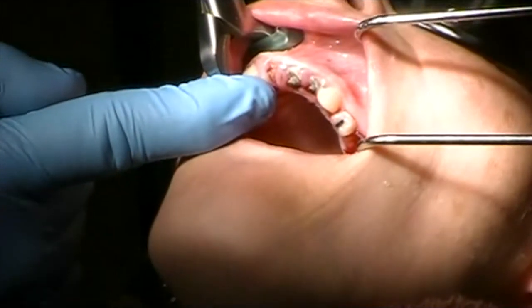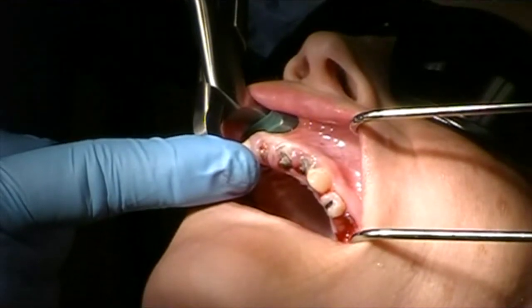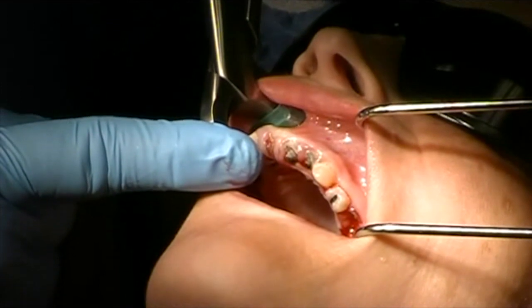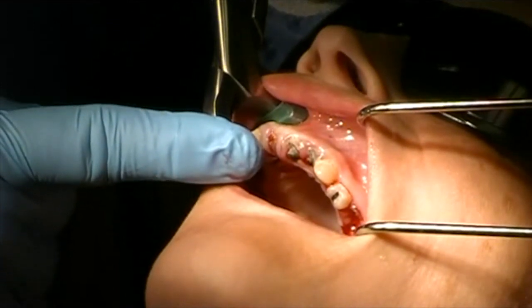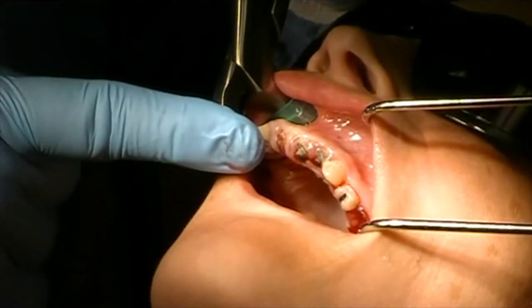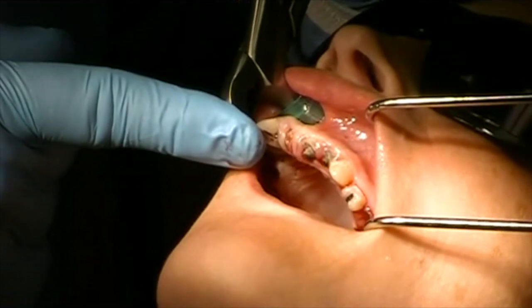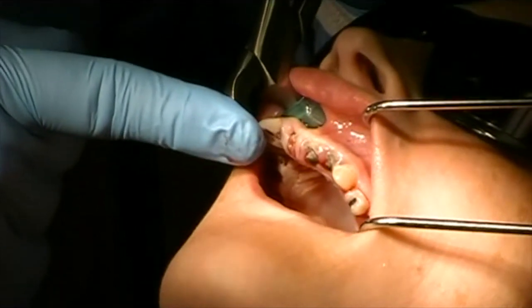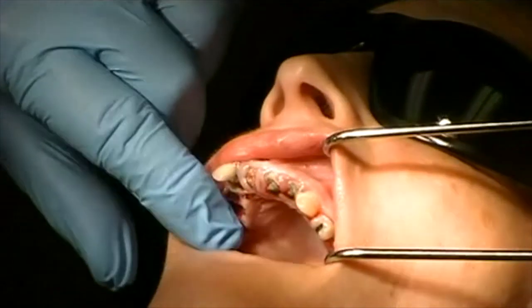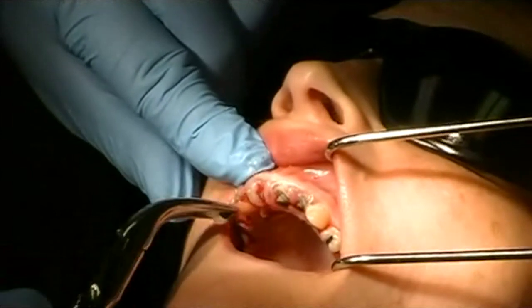Just kind of hold it there, slowly, slowly, slowly. And it just kind of broke there — you can see it move a little bit and it just kind of snapped. You can't rush into these extractions; we're not using physical strength, we're using leverage.